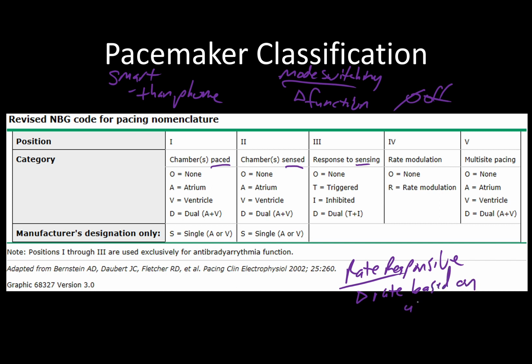Or their activity, based on patient activity. So it makes sense. If you're doing something, let's say walking up the stairs or cleaning the house, whatever, the pacemaker is able to pick up the pace so that you can have an adequate cardiac output to get that job done.